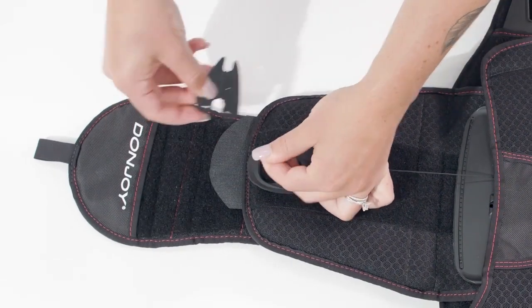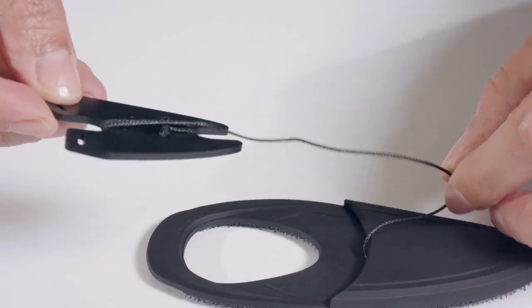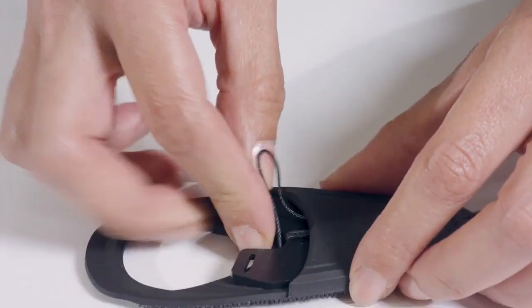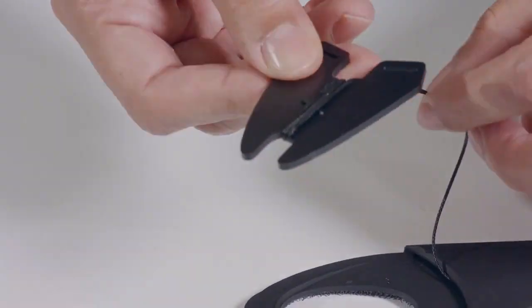To lengthen the pull tab, unwind the lace from the spool. When you have the desired length, place the lace spool back into the pull tab pocket. To shorten the length of the pull tab, wind the lace around the spool.